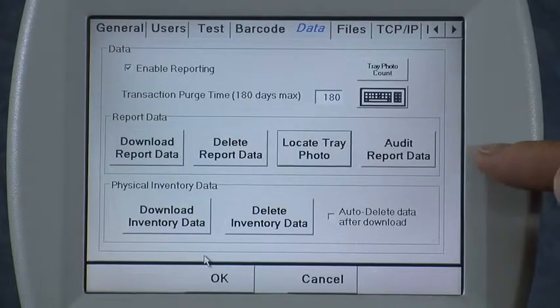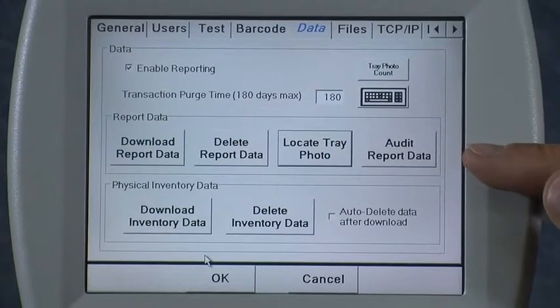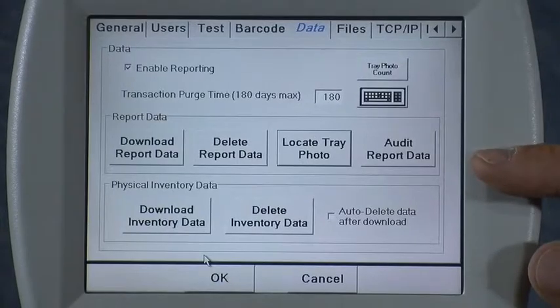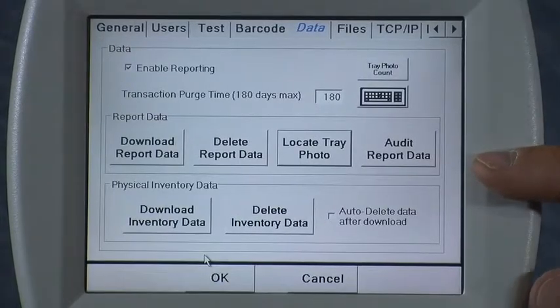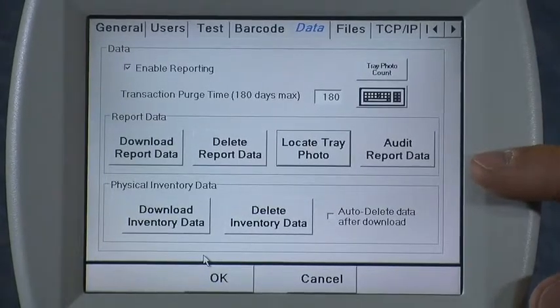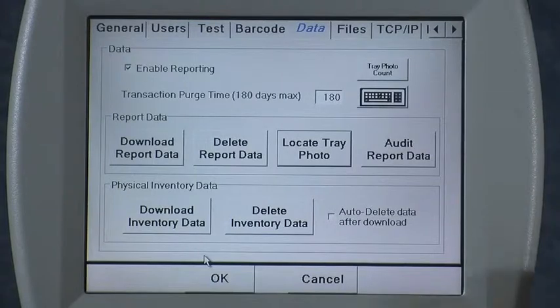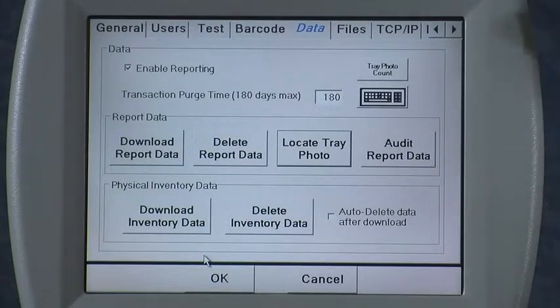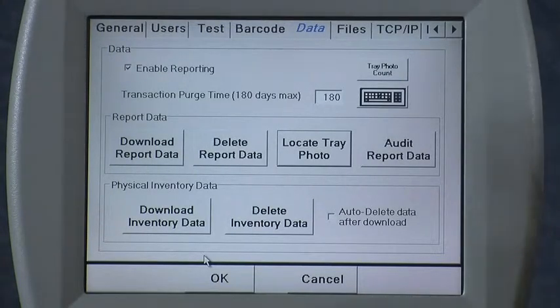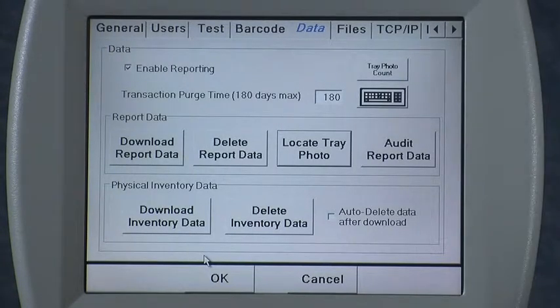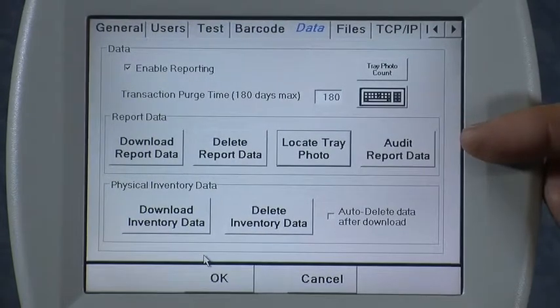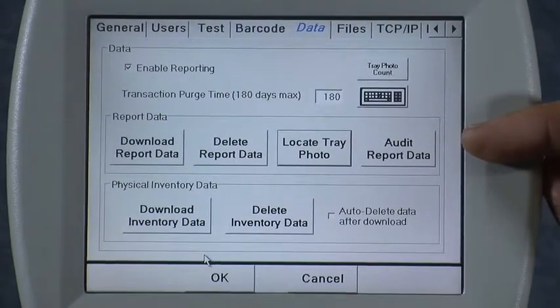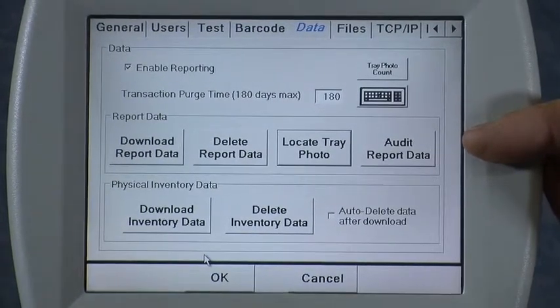The last button in this section is the audit report data. This button allows you to access a large number of reports that the icon can bring up right on screen, and also allows you to download them in a format that is easily importable into your computer. For more information about the audit reports, please consult that video.